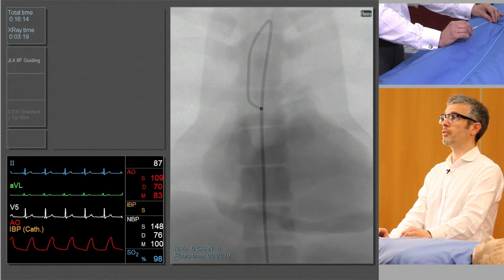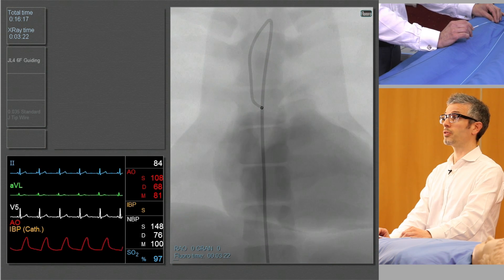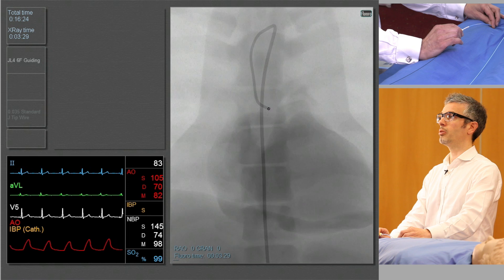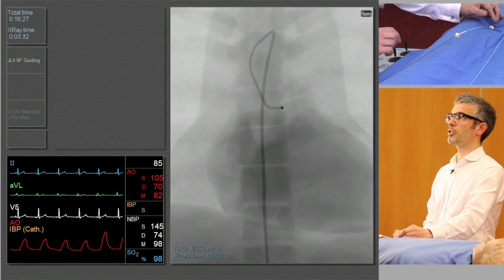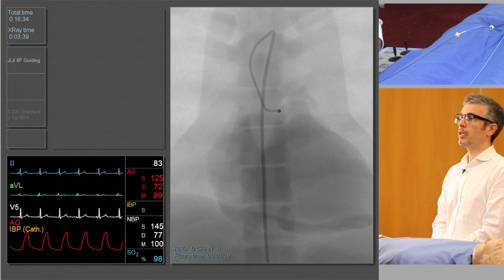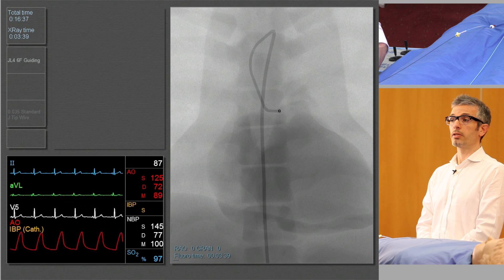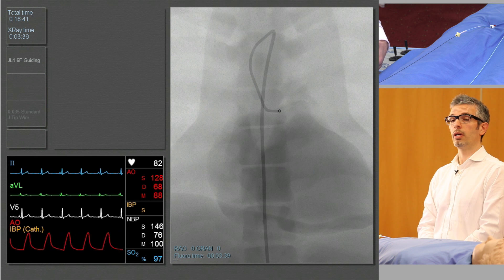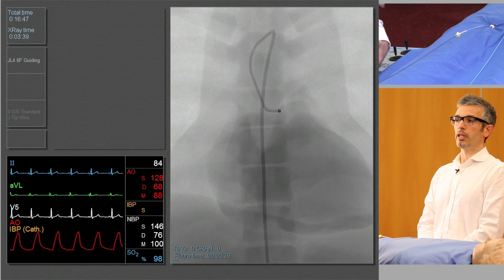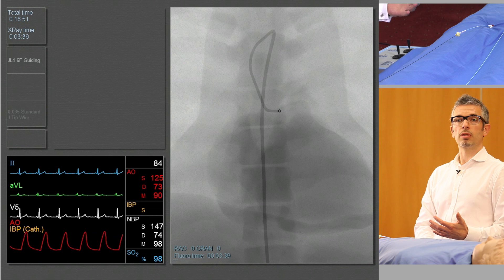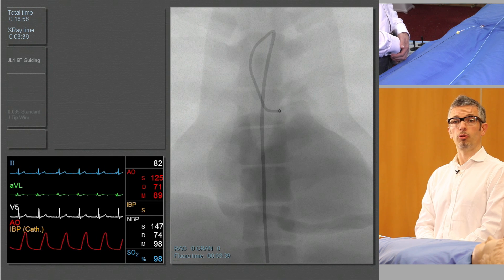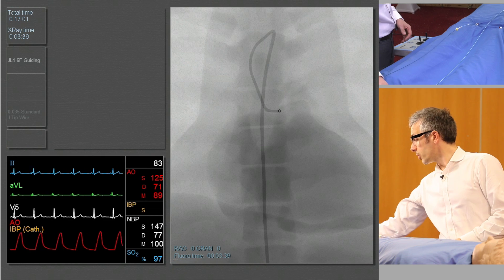A combination of those movements is usually sufficient to take the guide catheter into the left main ostium. If the guide catheter doesn't appear to go in straight away you may wish to take a small cine — but there we saw the catheter jump across to the right hand side of the screen and that's in the left main ostium now. Before taking any further injections of contrast, I want to ensure that my catheter is not up against the wall of the artery, because injecting at that time may cause dissection. I look at the pressure tracing from the tip of the catheter, and if that is not damped, I'm usually okay to inject. I aspirate on my manifold to make sure there are no bubbles in the system.